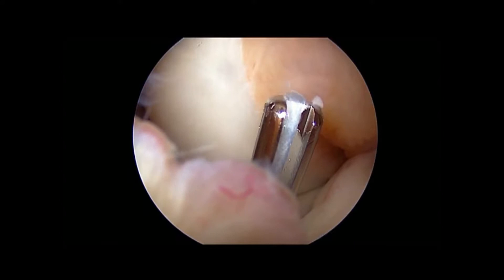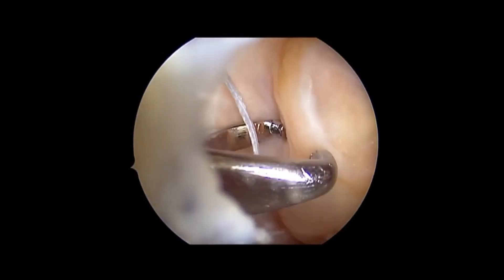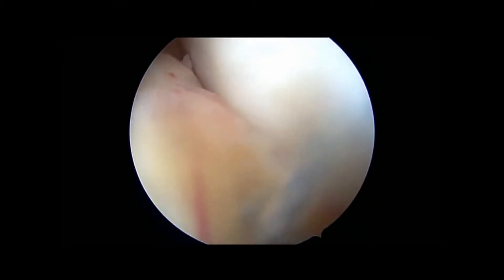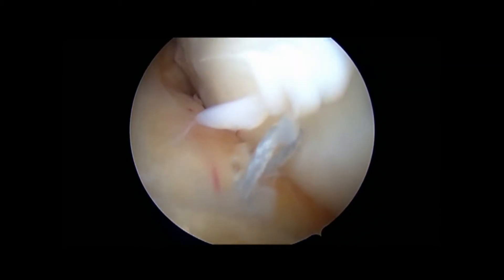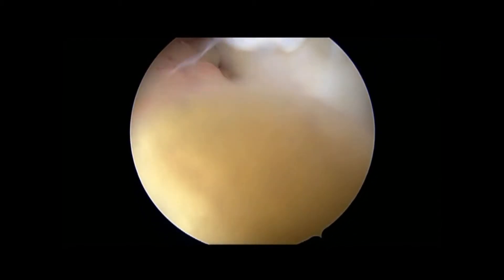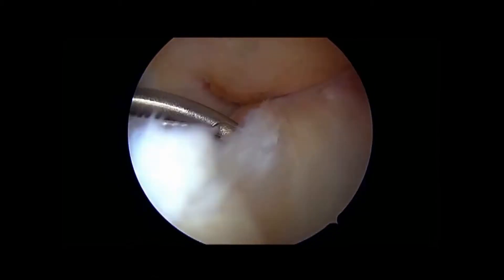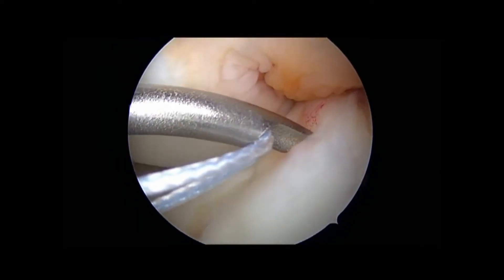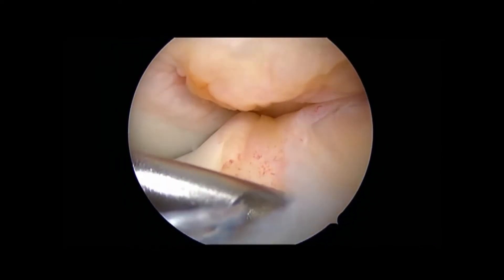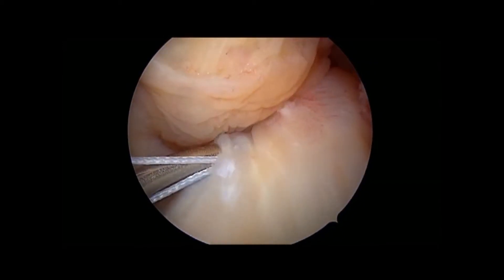The burr has an eye, used to introduce a suture as a shuttle, pulling the suture out through a portal on the medial side, and doing the same on the lateral side. Thirdly, introducing a suture with a suture passing device from the medial to the lateral side at the base of the ACL.